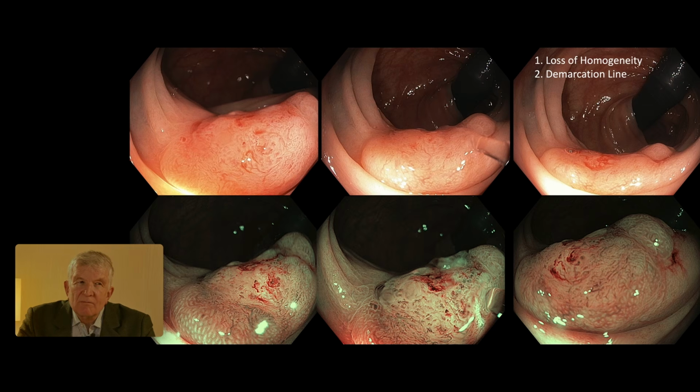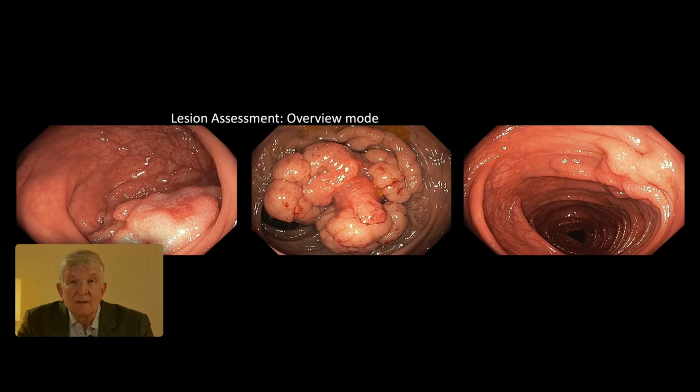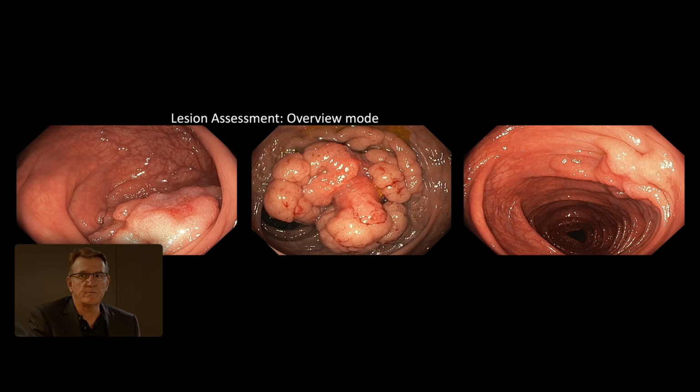But there's a huge grey area in the middle. So this is a non-granular type lesion? Yes. Which has a malignancy risk that depends on where it is in the colon and on its morphology. If it's in the right colon and it's flat, the risk of cancer is only about 4%. But this case is 100% cancer. That case is deeply invasive cancer. I don't even need to see the histology. Which means surgery? It's 100% surgery. It can't be resected endoscopically.